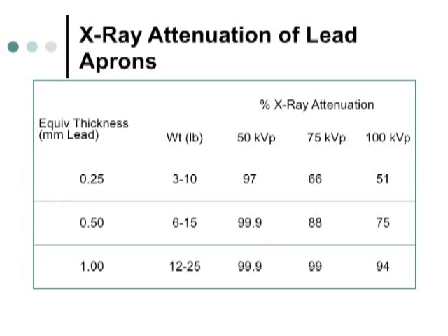Lead aprons are not designed to protect you from primary radiation. I went to one hospital and they said, we're going to have to replace all the aprons. Once a year, X-ray departments are required to fluoro all of their aprons to expose them and to make sure that they're not cracked or ripped or broken. In the OR, it's interesting, people like to fold up the aprons and put them in nice little piles. Well, what happens when you fold lead? It cracks, right? That's why we hang the lead aprons.